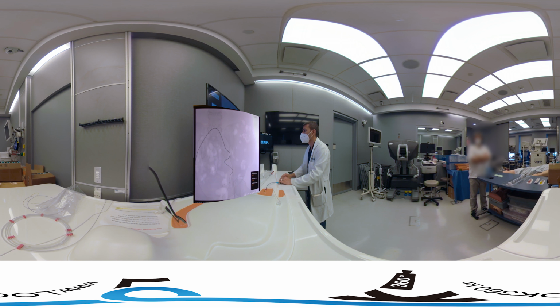So what we're going to do is get the microcatheter just a little bit more distal. We're going to bring back our wire and we're going to do our injection again. And now you can see that we're injecting and we're only seeing the uterine artery and the uterus there with the fibroids in them. This is a good point for us to stop before embolization. So for this portion, we're going to now deliver the embolic agent.